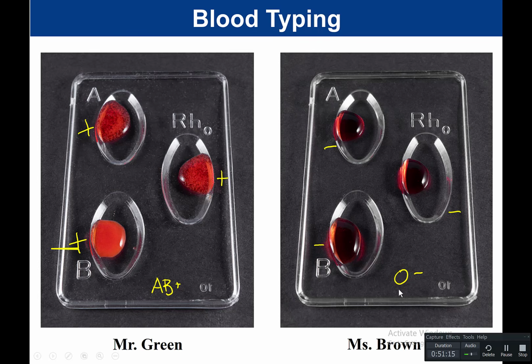And so for this part, if given a plate like this, you should be able to tell me based on these results, what is the blood type of this individual? And so this is how you would go about this. And so this concludes your final review video.